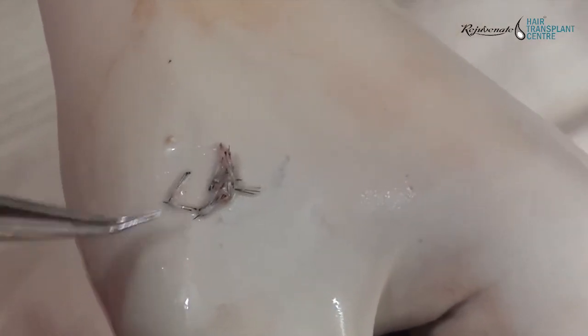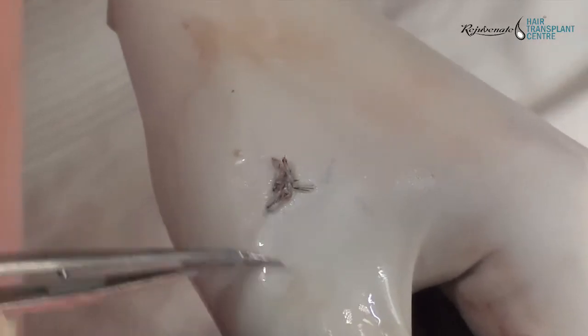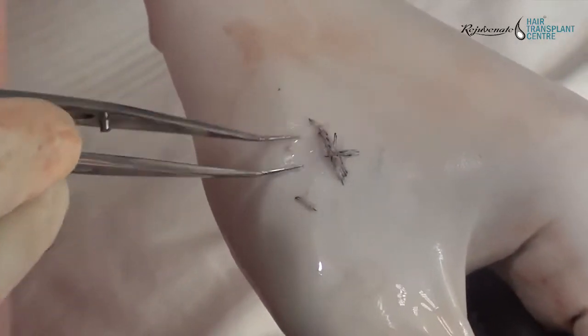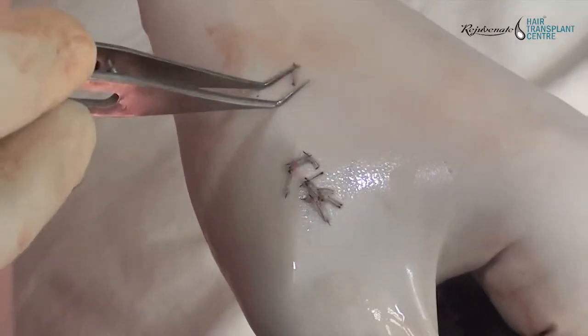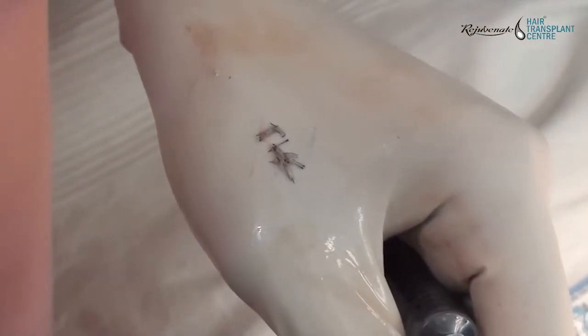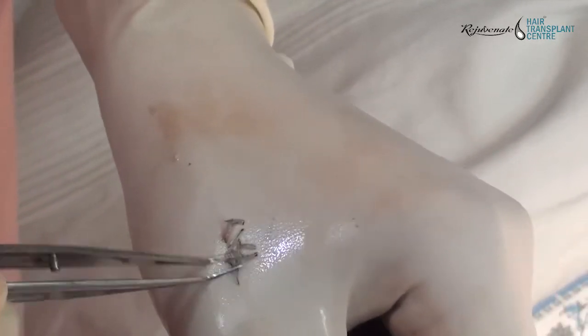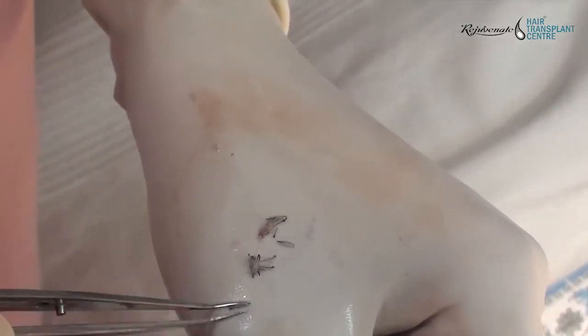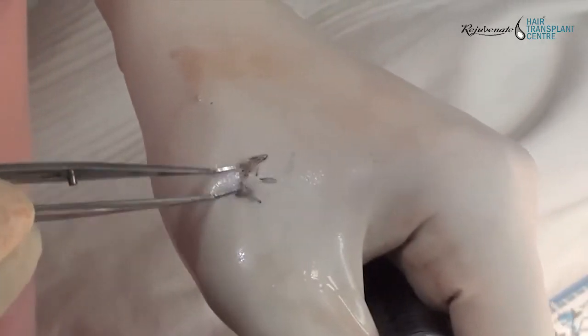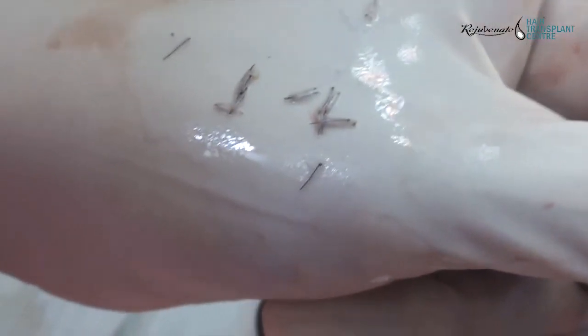It is a little tricky for assistants to place individual grafts on the implanter's hand because of the fibrin mesh — the grafts get adhered to each other. All grafts are attached with fibrin glue or fibrin mesh, so while separating, when you take out one graft, another graft comes out and needs to be separated individually.